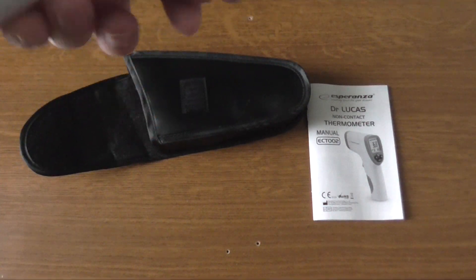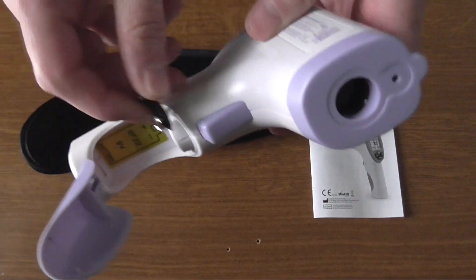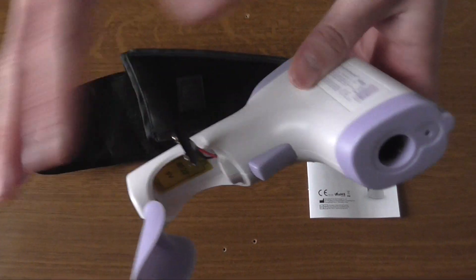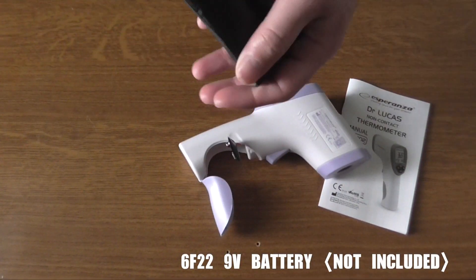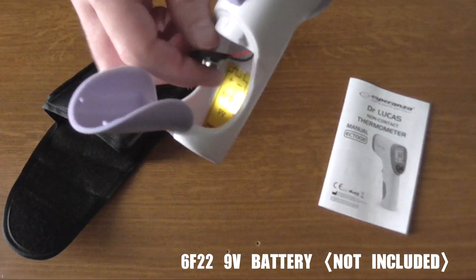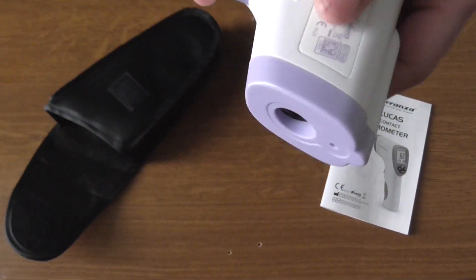There is also a compartment for the battery — you can open it like this. You need a specific type of battery that is not included, which is a real shame. I would really like to have the battery to install and use the thermometer right away, but you'll need to go and buy one.